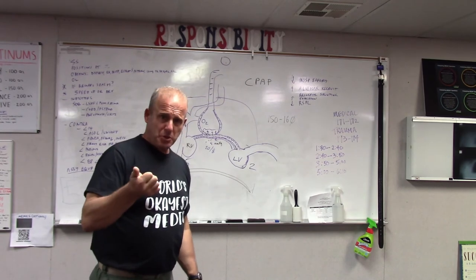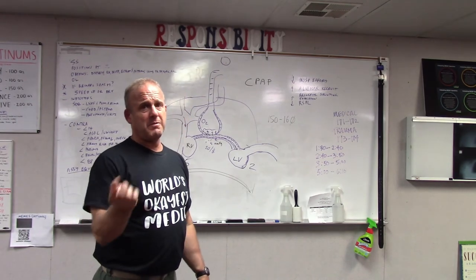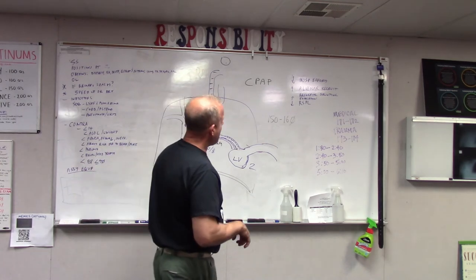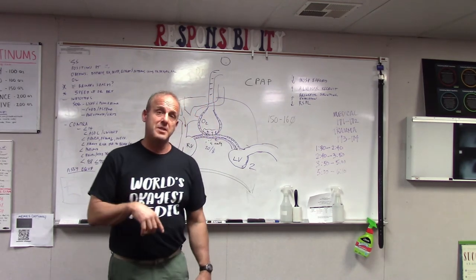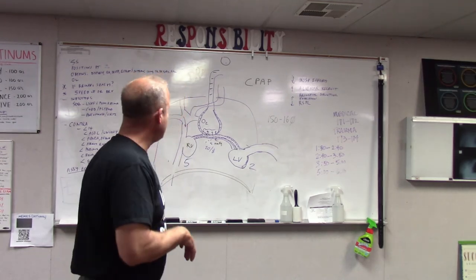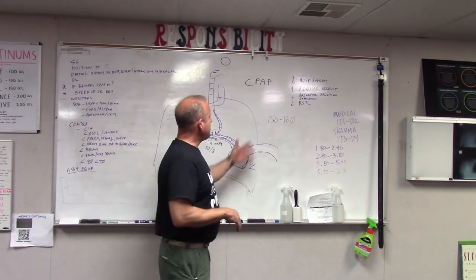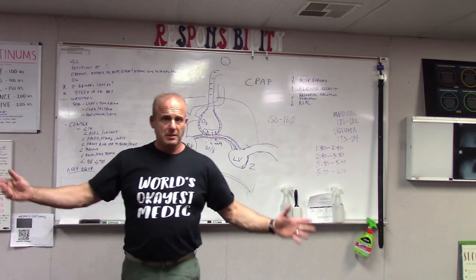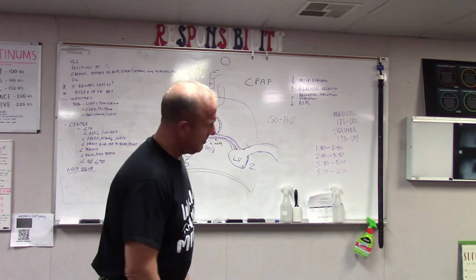I'll also watch the respiratory rate. Now, I have to admit, medic me of yesteryear wasn't really counting respiratory rate that much. I was kind of dumb then. Now I'm watching respiratory rate. Is that decreasing? And of course, I'm listening to lung sounds, watching the SAT, other stuff like that. If everything's getting better with an albuterol, and the patient's like, oh my God, I feel so much better, yay. Good. Go with it.